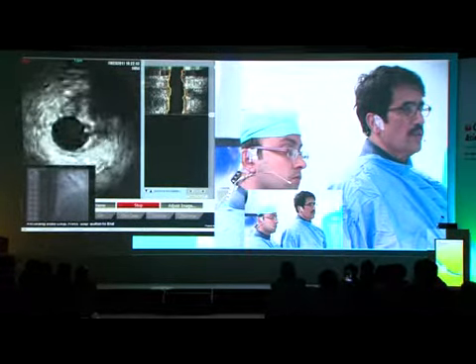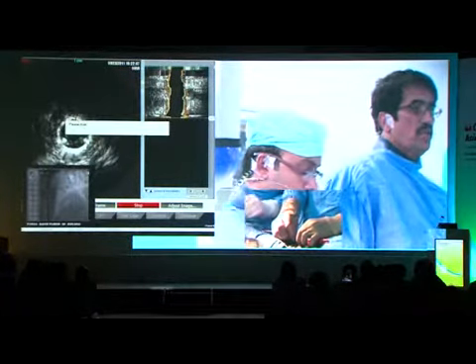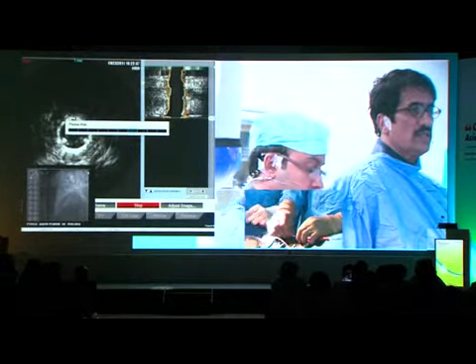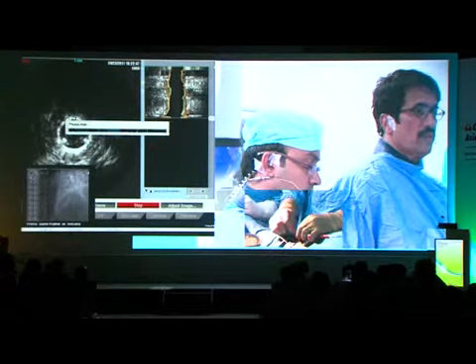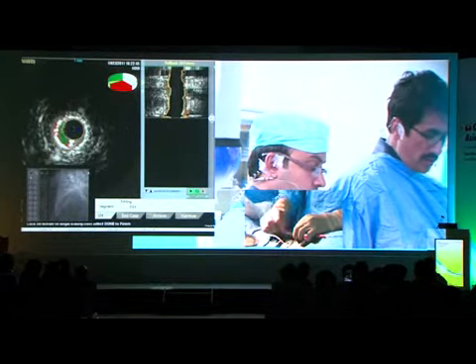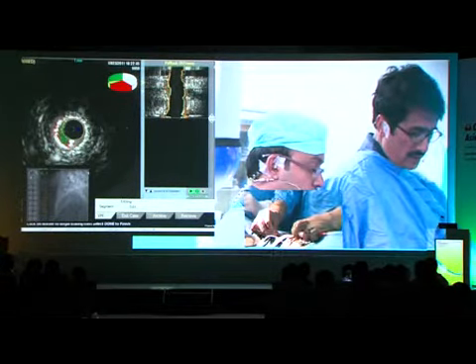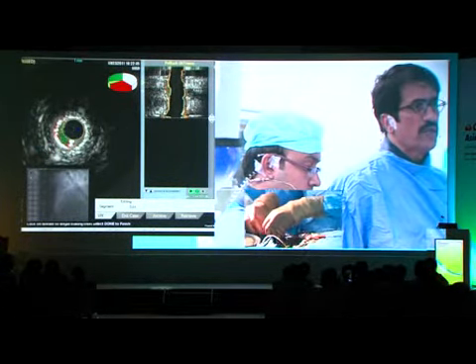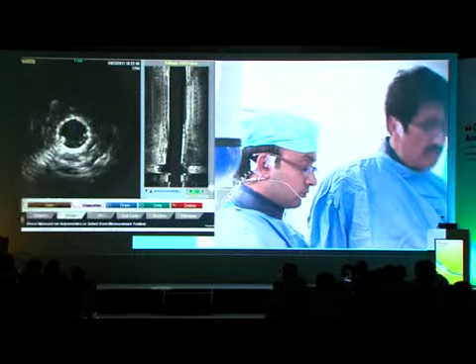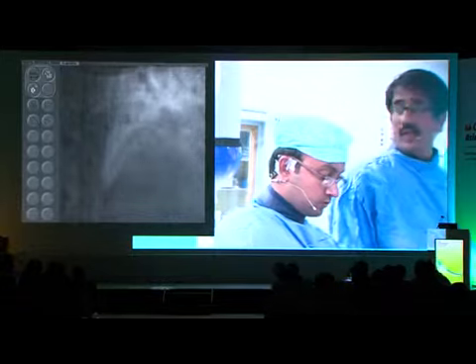We'll do all that. The whole idea was to work with you on the bifurcation, a stent which doesn't need any metal crush. It of course needs 2 stents, but we are pretty confident about not missing out the ostium. So we are going to be working on the distal portion beyond the stent in the diagonal, and maybe proximal LAD optimization. We would switch you back to the other lab.